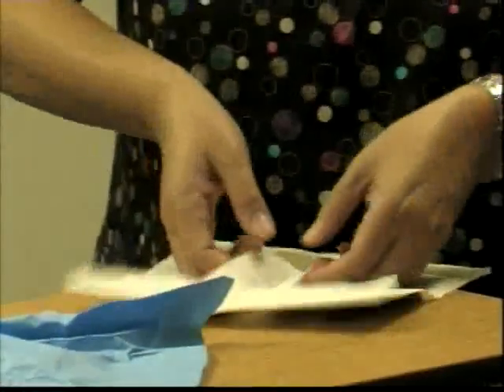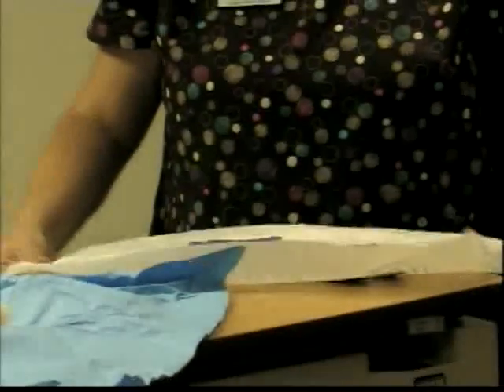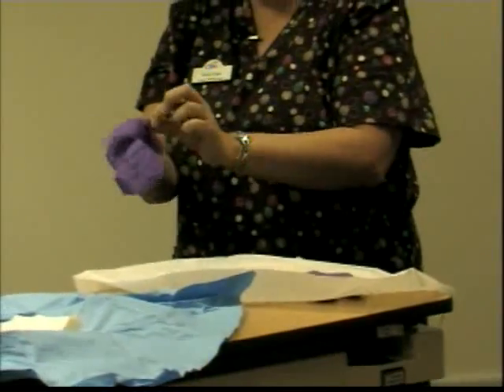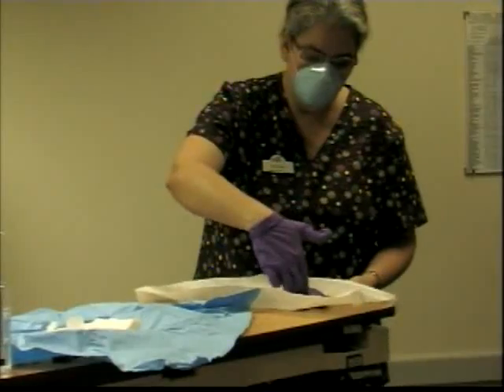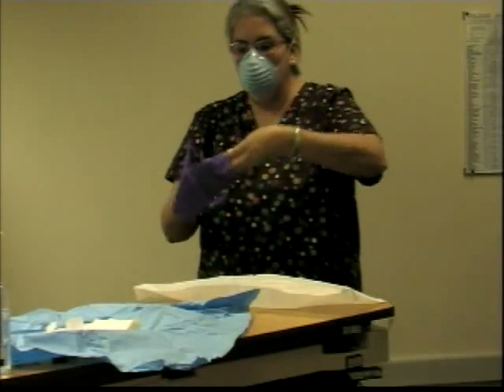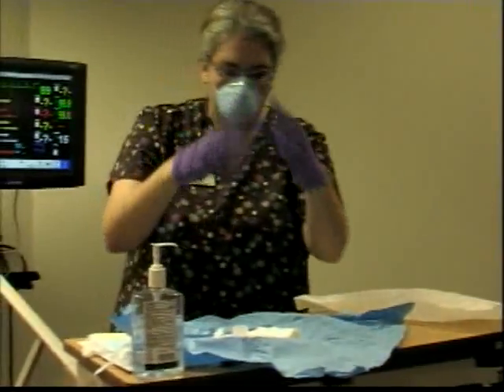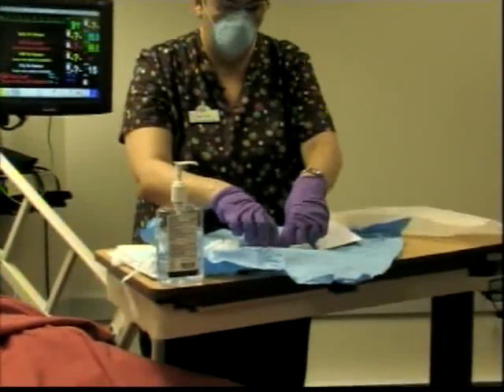So I'm going to come over here. Okay, let's go ahead and put our gloves on. Make sure that you do not cross that with your sterile field. Got your gloves on here. You're shaking your thumb, grabbing the other ones. You have it above your waist. Okay, now you can have both hands inside here, and you can rearrange everything you have.